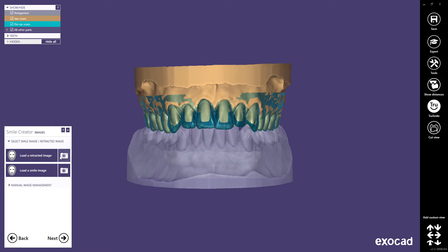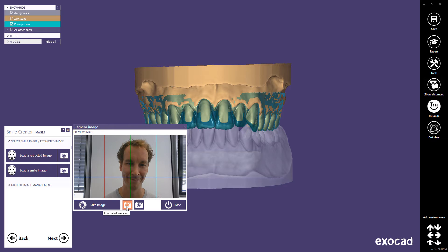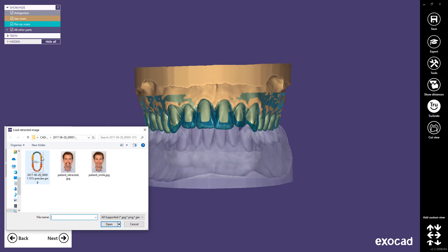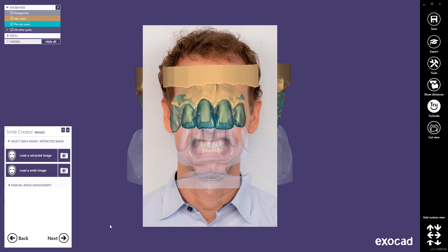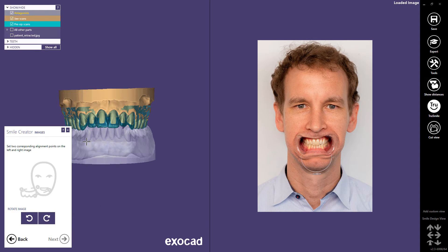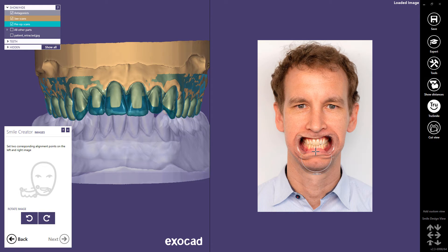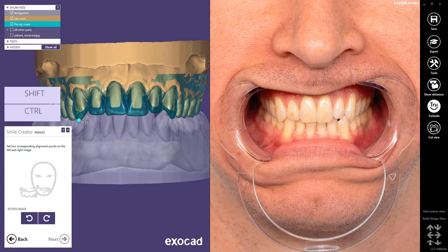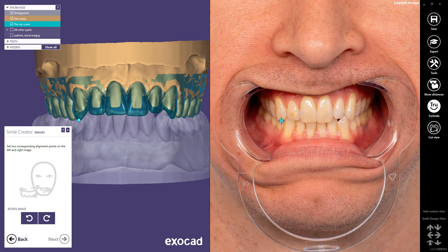You can use the camera icon for taking a photo directly from a connected camera or webcam. If different cameras are connected, you'll need to choose the desired camera. Alternatively, you can load an image from a file. Load the retracted image. As soon as you load a two-dimensional image, it will be converted to a 3D mesh, and we do the 3D registration by setting two corresponding alignment points in three-dimensional space. Set two corresponding alignment points on each of the left and right images. The greater the distance you choose between the points, the better the scaling result will be.